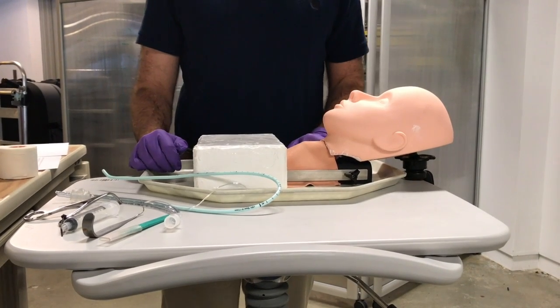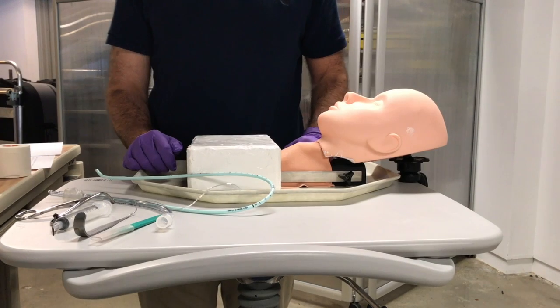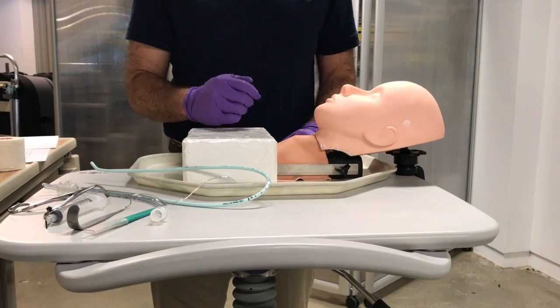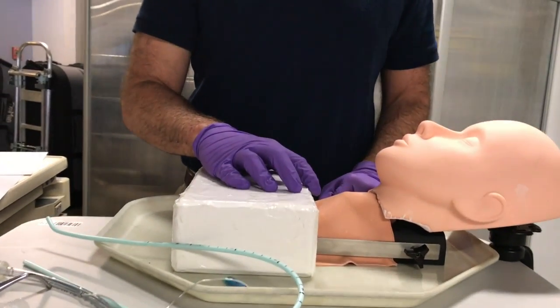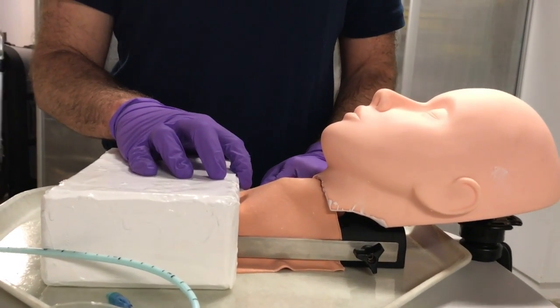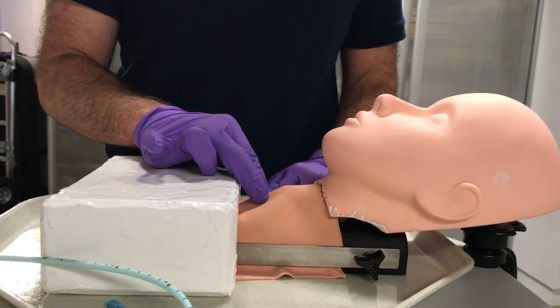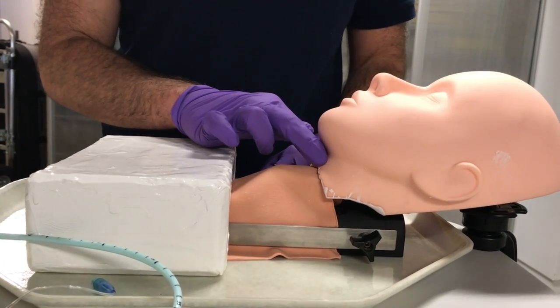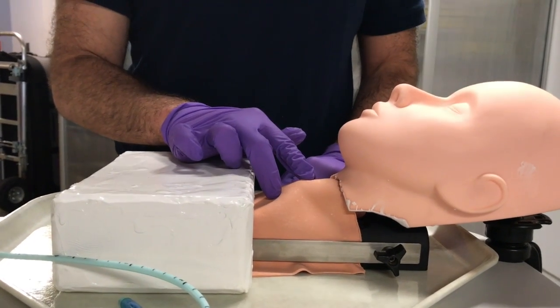The initial step for all three cricothyroidomy techniques is landmark identification, and it is done the same way with each technique. I like to start from the sternal notch and work my way up from there, feeling my landmarks. Your first prominence going up from the sternal notch is going to be the cricoid cartilage. Above that you'll feel the thyroid cartilage, and above that you may feel the hyoid bone. Your cut goes between the cricoid cartilage and the thyroid cartilage.